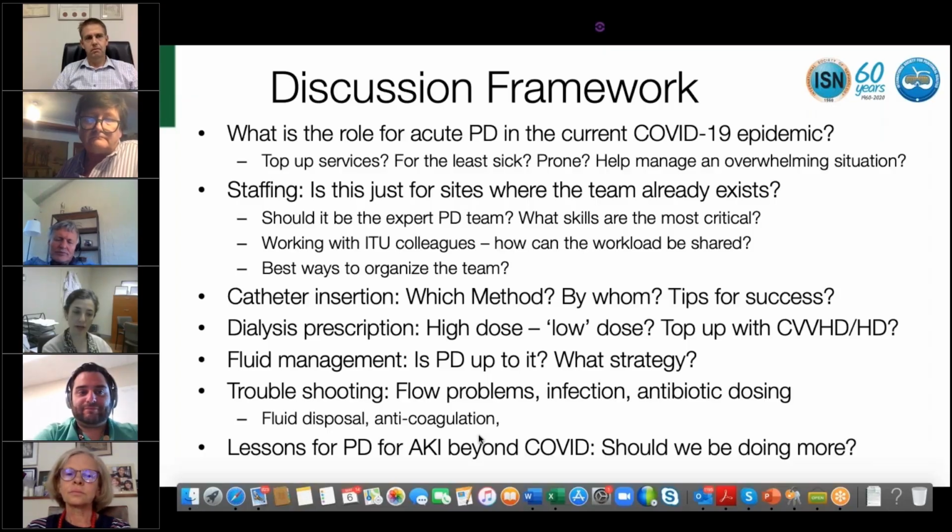And we started with the manual PD supplies that we had over that first week or so. And we went around the different ICUs. There were 3 or 4 of us, and we did the PD exchanges. At the same time, we showed the nurses how to do them. They were extremely eager. I couldn't be more proud to be part of this institution. Honestly, we all came together, and we also gave them laminated cards on step-by-step procedures on manual PD.